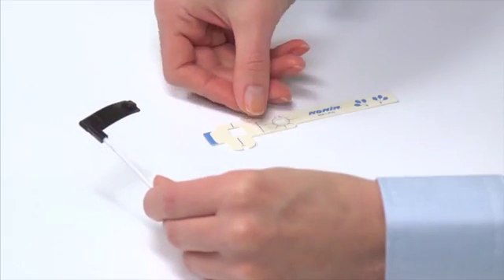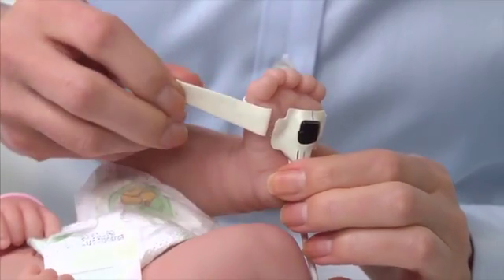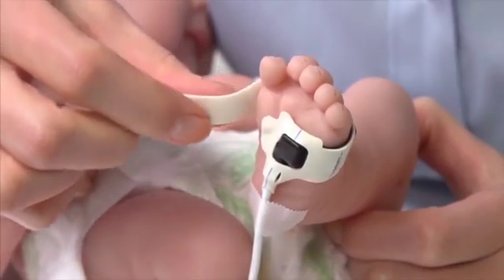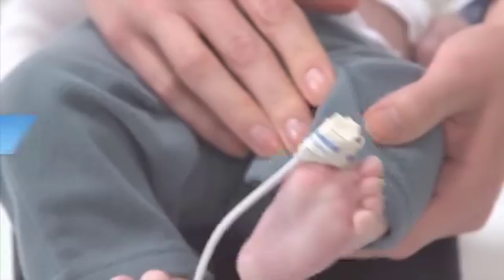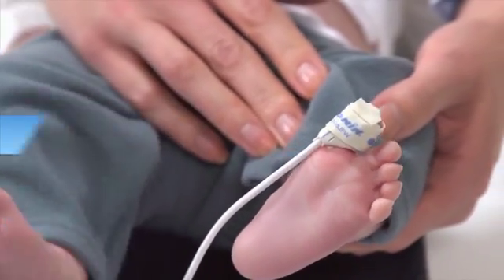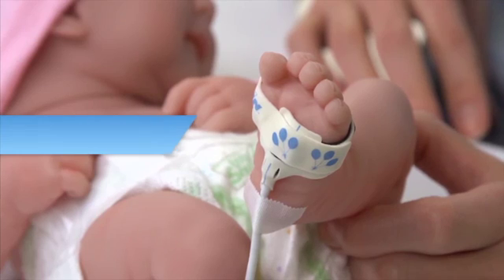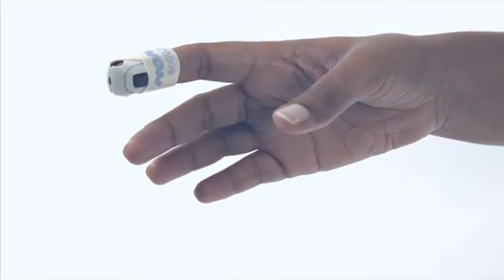Flex series sensors and FlexiWrap adhesive wraps are a two-part sensor product. The Flex series sensors may be used multiple times for the same patient or for another patient with proper cleaning and a new FlexiWrap. The FlexiWrap is designed to secure the sensor on the large toe of infants or the lateral foot of neonates up to four pounds or two kilograms in weight. Several sizes may be used for adult and pediatric finger placement as well.